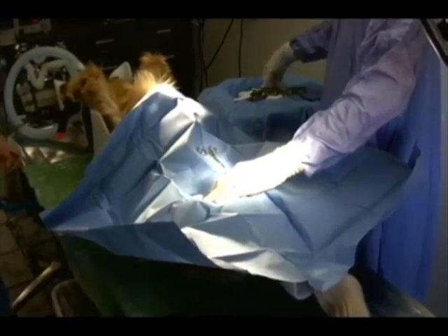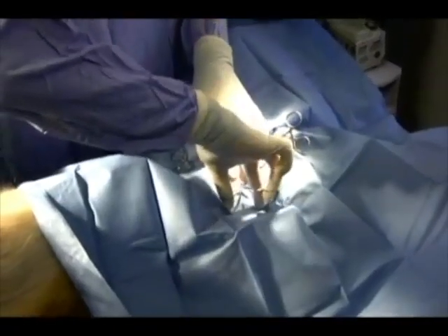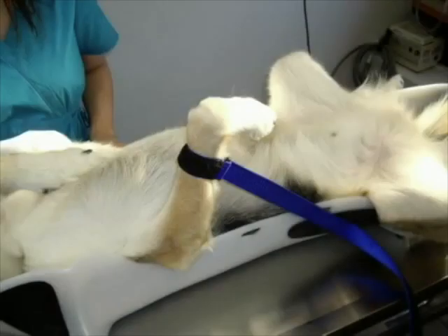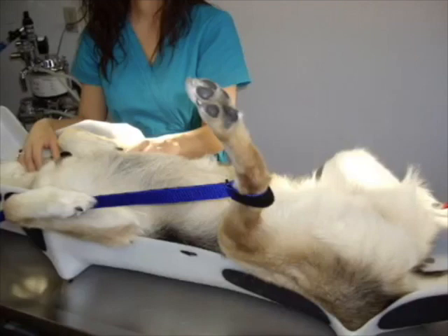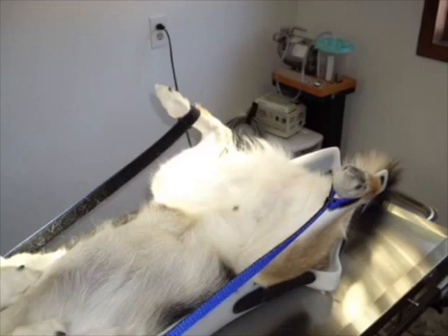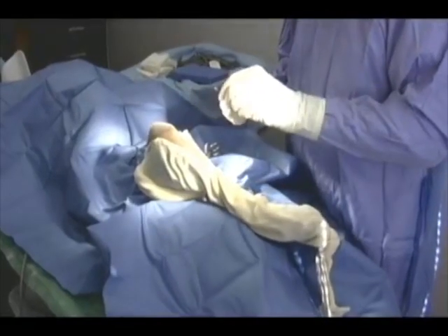Furthermore, because of the numerous straps and anchors on the Positioner, limbs can be positioned a number of ways for procedures like mass removals, foreign body exploration, episioplasty, and cruciate ligament repairs, once again eliminating the need for someone to hold.